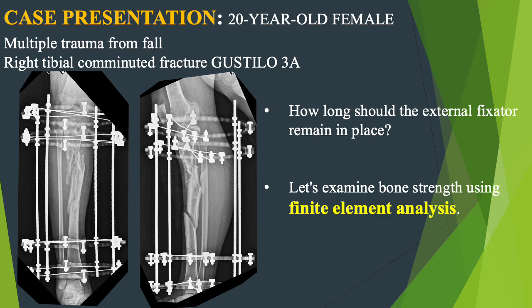This raises an important question. How long should the external fixator remain in place? To address this, we decided to examine bone strength using finite element analysis.